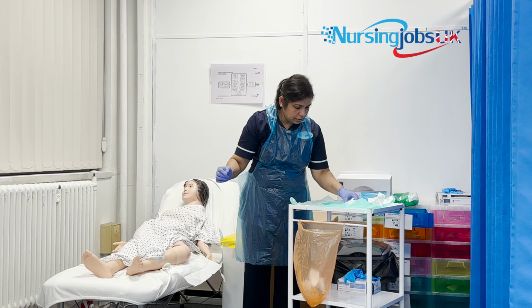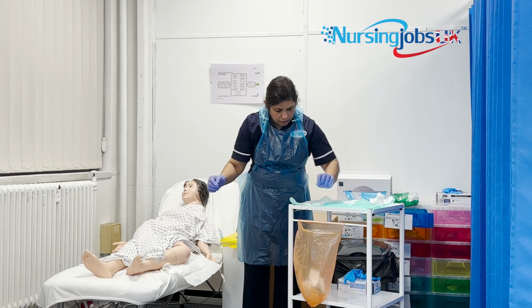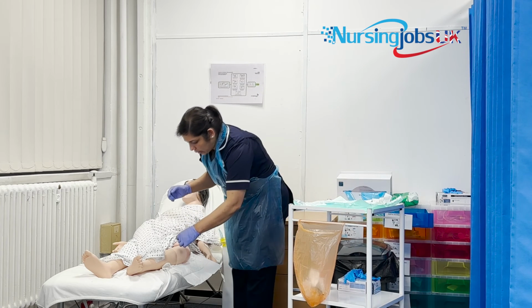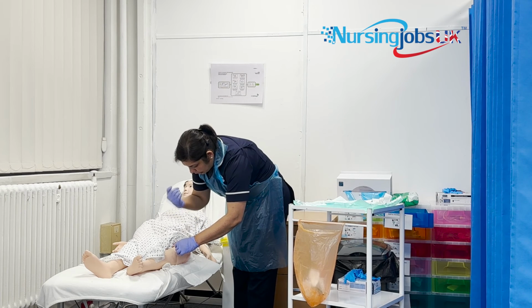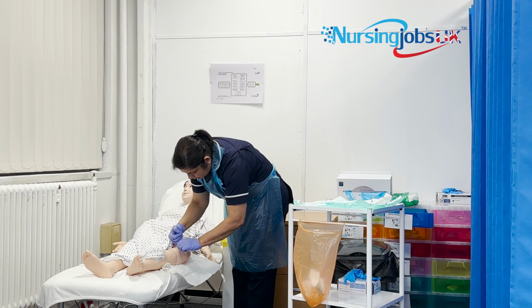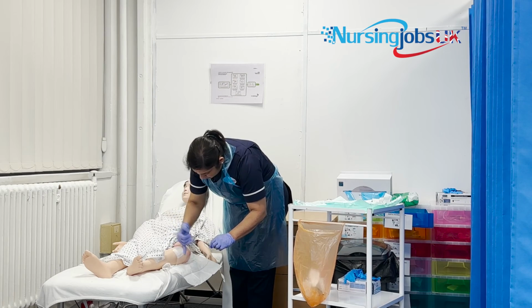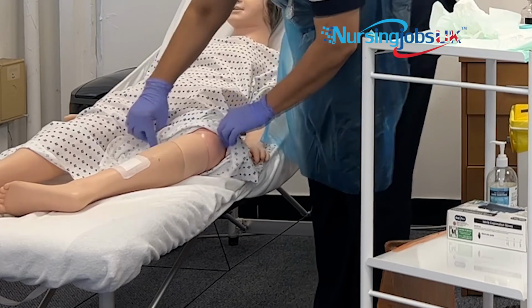Now you will be able to take your dressing. So it will be better, you can open it with one end with one hand. Now it's ready. Joe, I'm just going to stick the plaster on you. Okay. So now you will be able to use the back hand of the other hand, and without touching the inside. Okay. So now the dressing is completed. I'm just going to cover you.